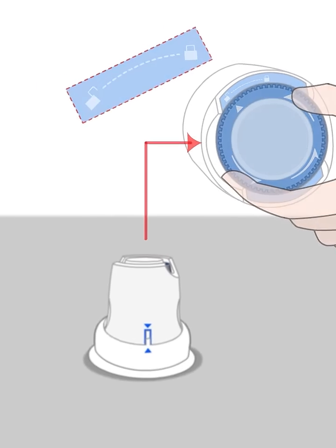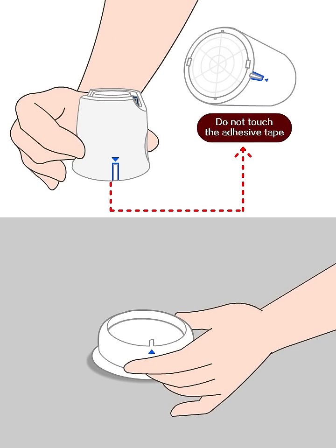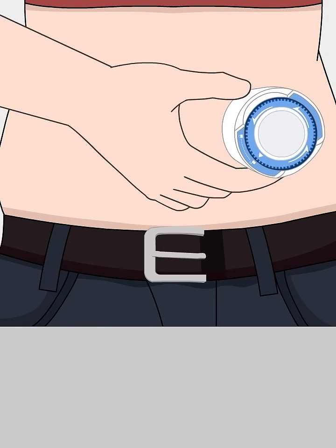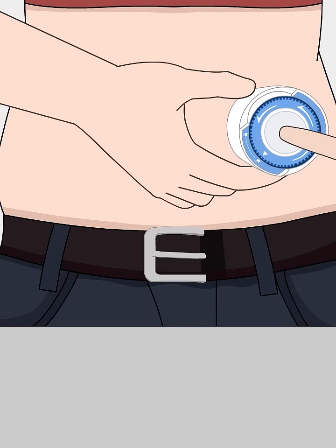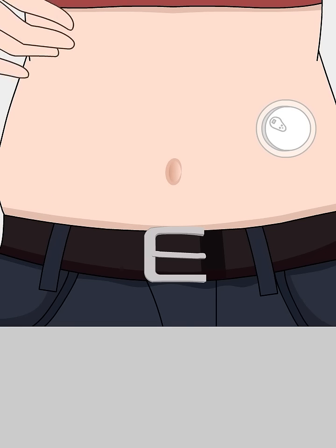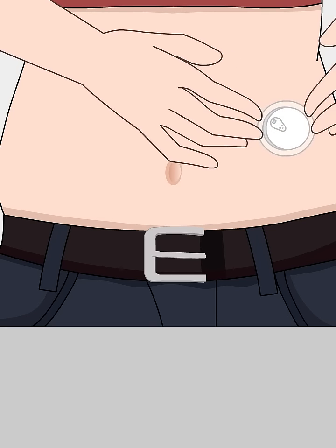Gently lift the armed sensor applicator straight up. Do not touch the bottom glue side of the armed sensor applicator. Hold it against the disinfected site and press the white button at the top firmly. Then gently and vertically move away the implantation tool. Press the sensor and adhesive around it to make sure it sticks securely to your skin.